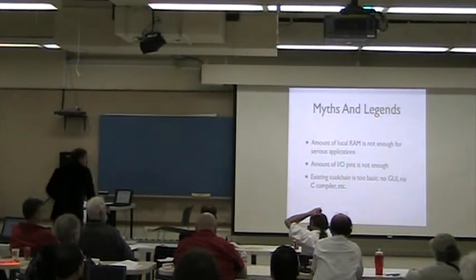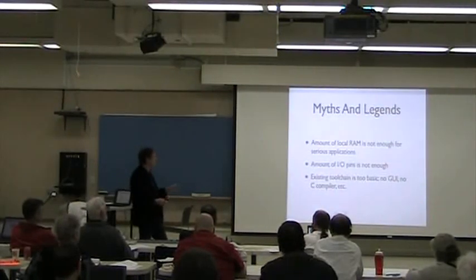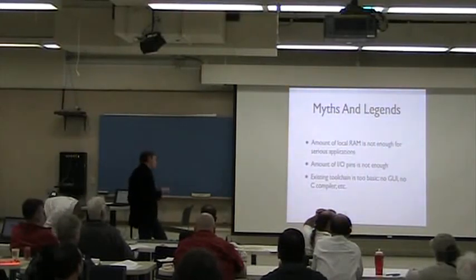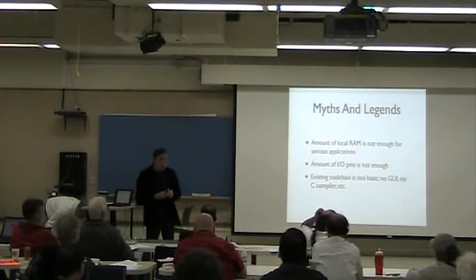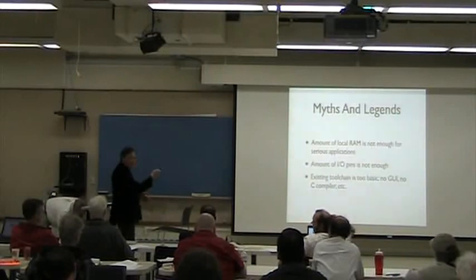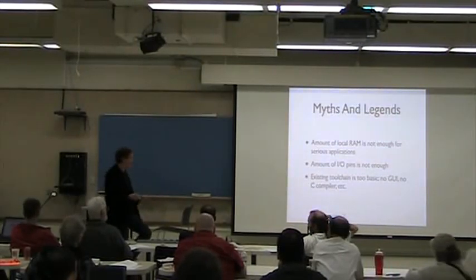And these are myths and legends. So we were told that 64 words of RAM is not enough for a serious application. Hearing aid is a serious application. And yeah, of course, sometimes we were not that comfortable with this amount. We wanted it to be more. But finally, it's working with the 64 words of memory. So 64 words per core is enough.